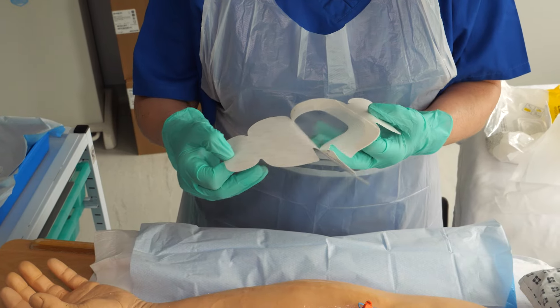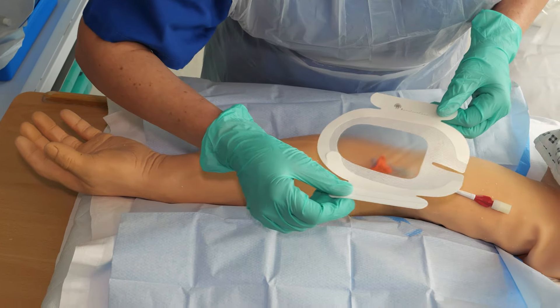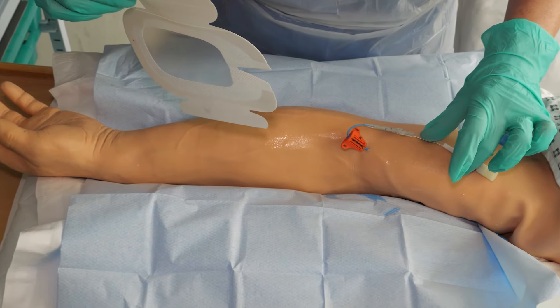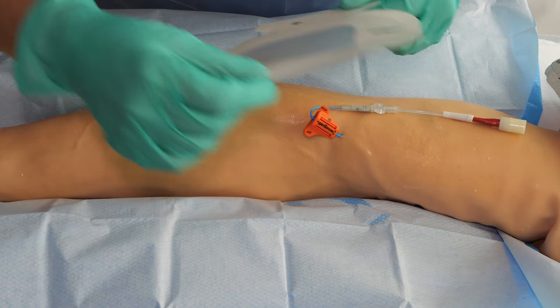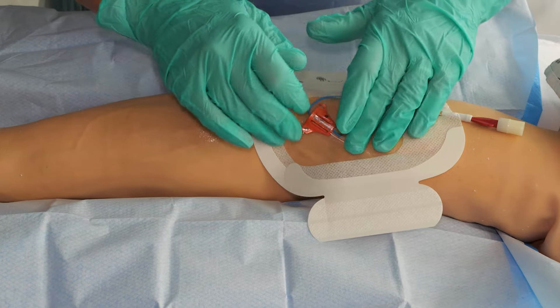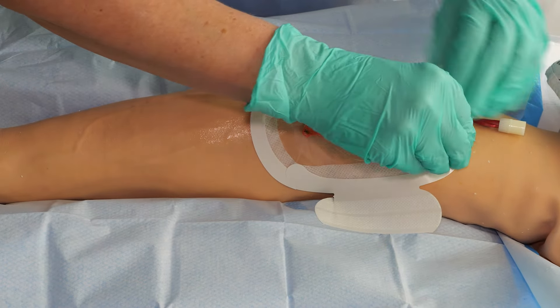Take the backing off the dressing with the adhesive side facing the skin. Lower the dressing over the PICC, covering the entry point, secure cath, and the white T-shaped part. Gently massage the dressing to ensure it adheres to the skin. Do not stretch the dressing as this can pull the skin and be very uncomfortable.